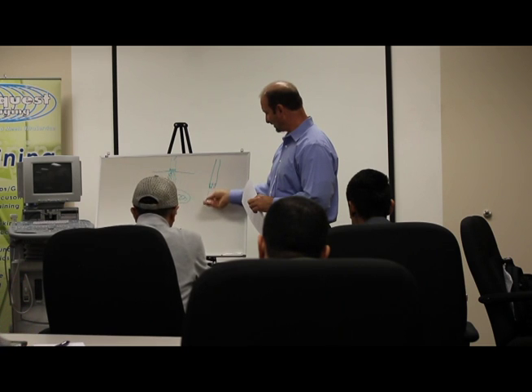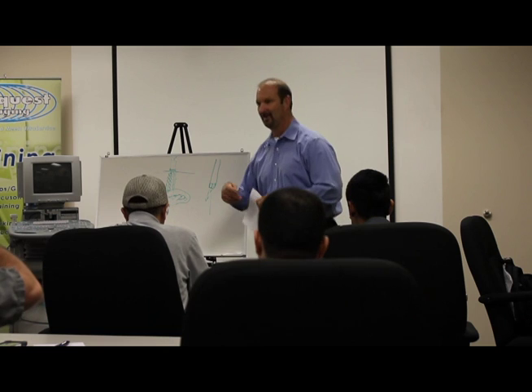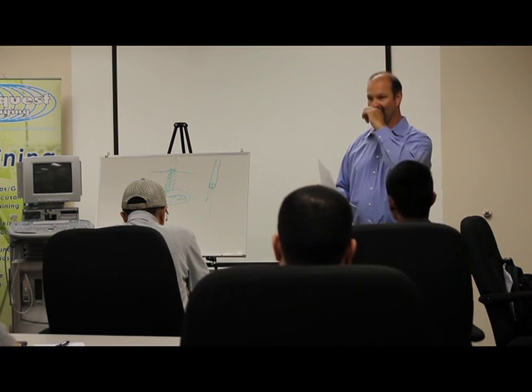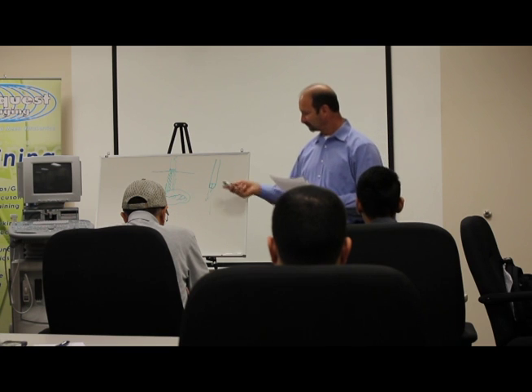One is always sending, and one is always listening. So you have two crystals in a continuous wave transducer. These are not 2D transducers. They're non-imaging probes.